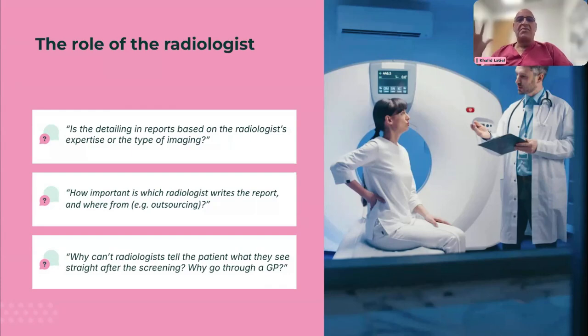So my scenario I was talking about was patients there with me. They're asking the question, I'm doing ultrasound on them. Most of the time, the patient's not here with me. That's why we can't tell them anything.